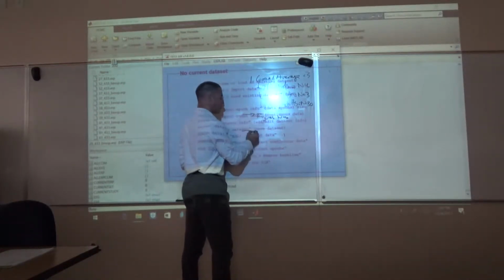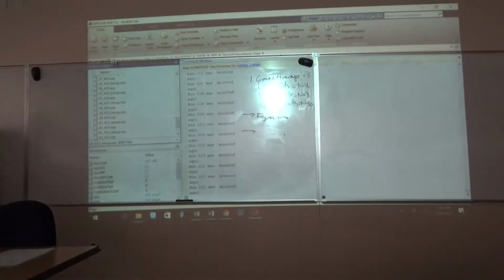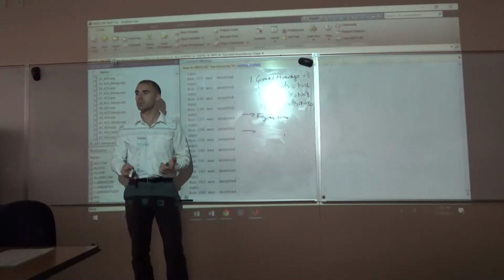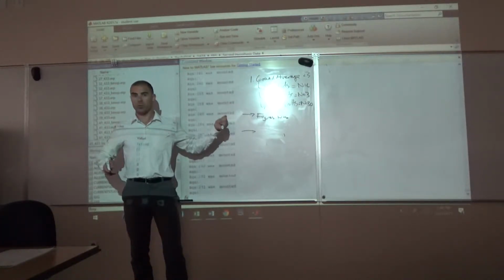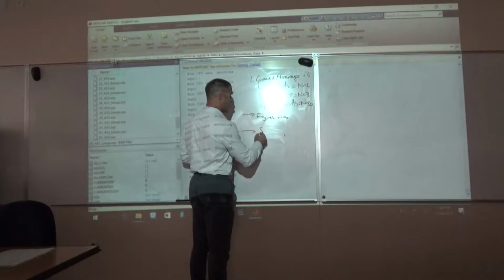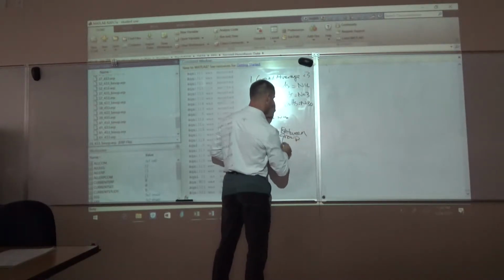And then what do we want to do after we create figures? Or what do we need to do? Fine, you guys have already done this. What do we do? Well, that's what the figures are. The figures are the plots. We want to measure them, right? ERP measurement tool, we want to actually get the stats. So I'm going to show you basically how to do your stats for between group analyses.